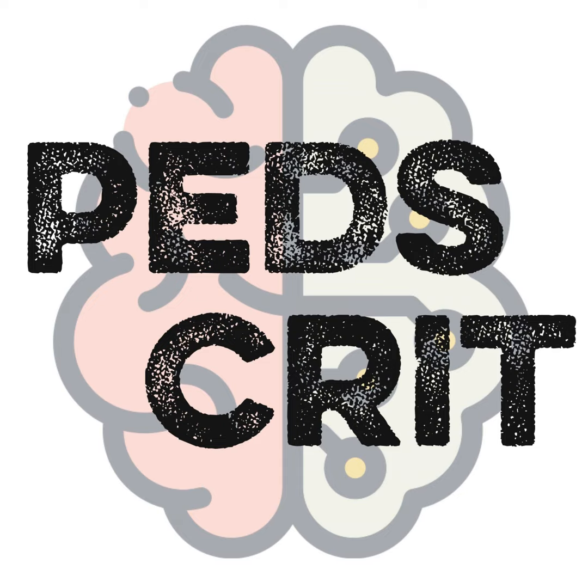Driving pressure, unfortunately, has never been tested in a larger trial. People have started to do pilot trials in driving pressure, but people haven't tested explicitly a driving pressure above a damaging limit versus below a damaging limit or something like that. And the concern about residual confounding in the reanalysis remains. Even if you reanalyze 4,000 patients, if your conceptual model has an unmeasured confounder, like sicker patients have less compliant lungs, then all you get with a large analysis like that is a more precisely biased answer. So the concern about residual confounding in driving pressure as a concept remains.